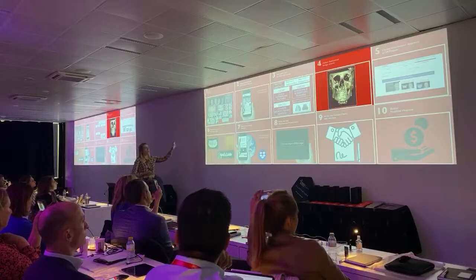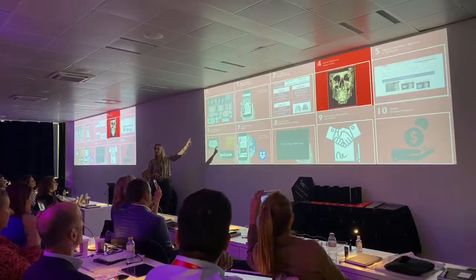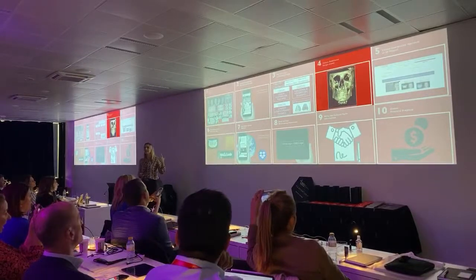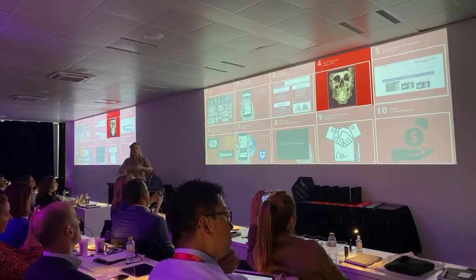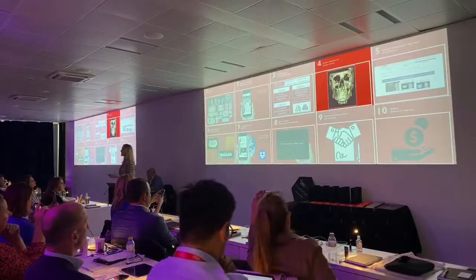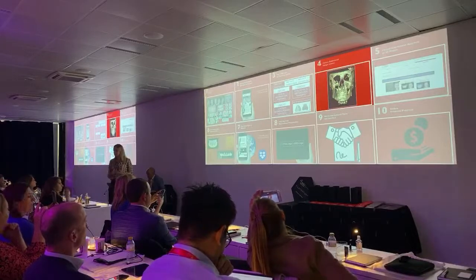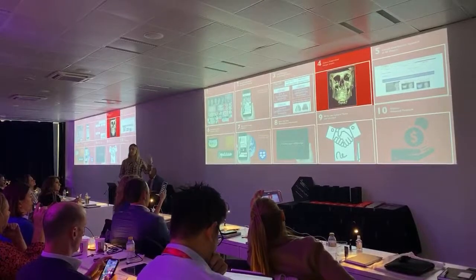So while the patient is going to do the CBCT, I already order from the planning center what I want, because the planning center is already designing the ideal. Then you will use the CBCT to try the treatments, to make the planning of ortho or implants, but they don't need it to start designing, so I'm saving time, okay? But when the image is with us, we send it to the planning center.